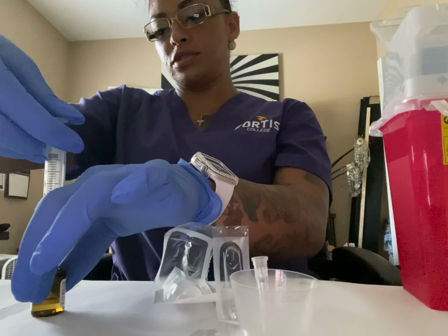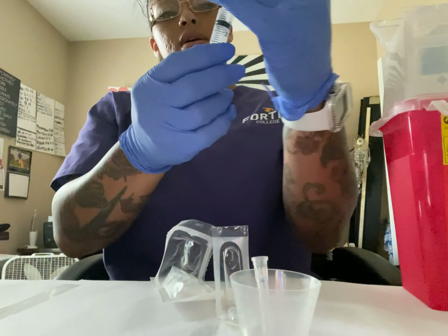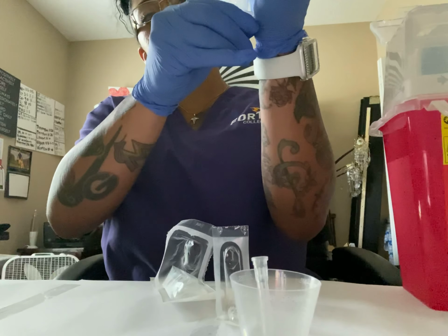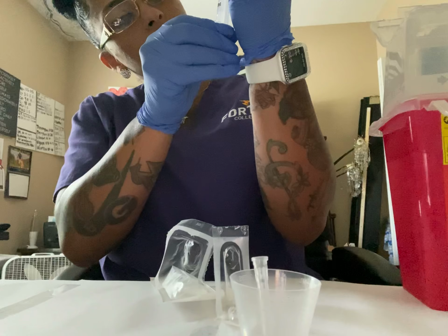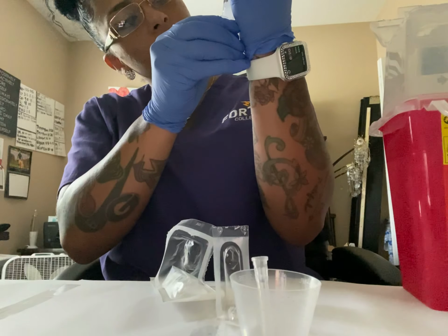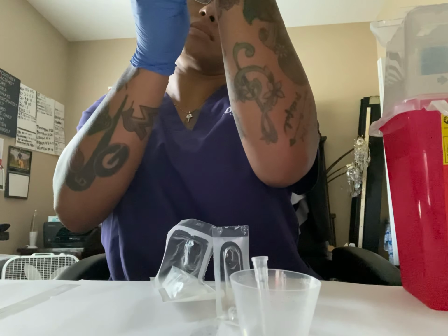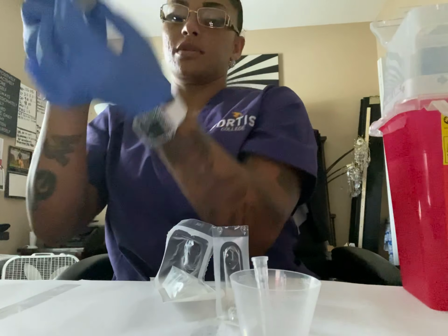After that, I'm going to go into the solution, and then I'm going to invert and pull back the same amount. So the equal amount of air, we're going to pull back the same amount of solution from the vial, to 1.5 milliliters. There we go. I'm going to turn this back this way.